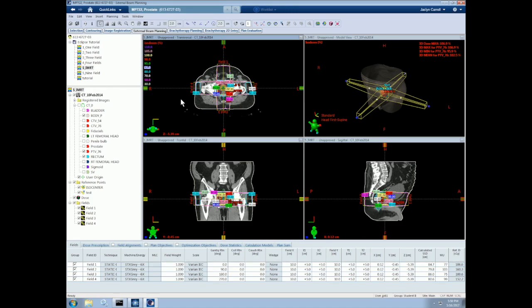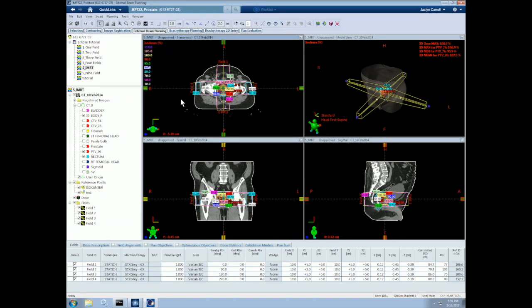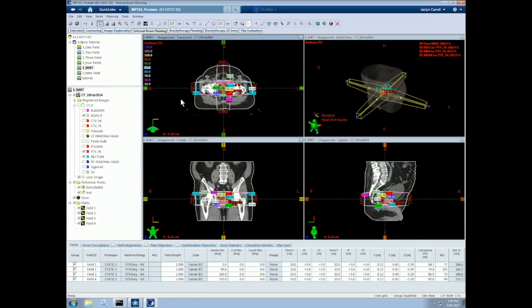Lastly, we need to check the beams for the need to fix a jaw position, for instance, in the shoulder region of a head and neck case. The optimization will define the fluence and then set the jaw position to include the entire fluence and PTV. However, there's an option to manually override the jaw position and you will need to know which beams to use this option for and set their collimator settings prior to beginning the inverse optimization.